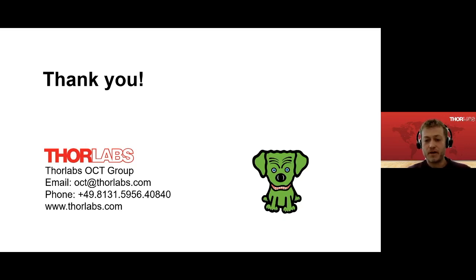First of all, our PSF gets broader, just because we're defocusing. It's the same for microscopy or other techniques. And the second is, since we use this confocal gating, at least with standard scanning OCT, we have a focused beam into the sample or tissue, and we have the backscattered light imaged again through the pinhole. As we move out of this focal range, out of the Rayleigh range, the light will not couple back as efficiently into the pinhole or the fiber in this case, and that's why we lose sensitivity.